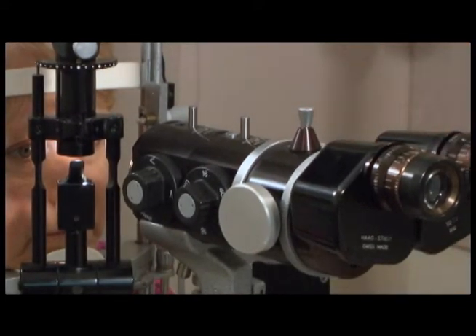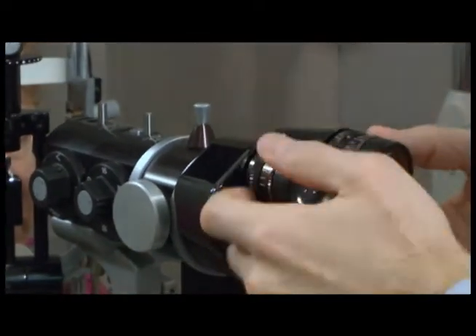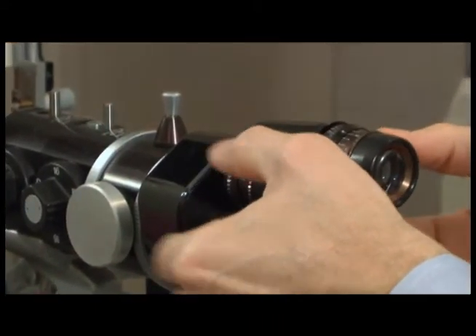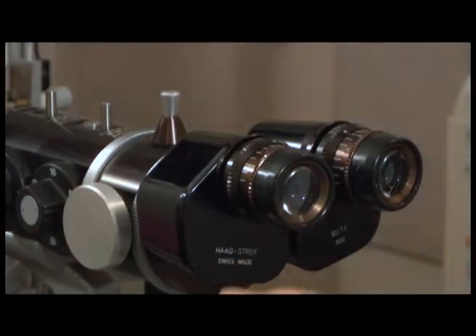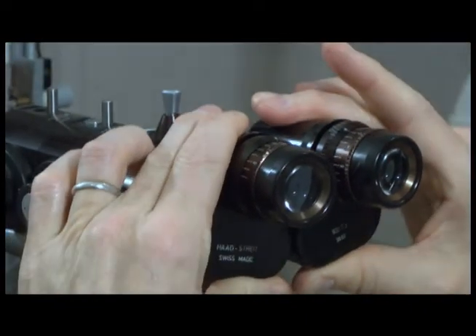The oculars should be set at zero unless you are trying to correct your refractive error. The oculars can be moved to accommodate your particular interpupillary distance.